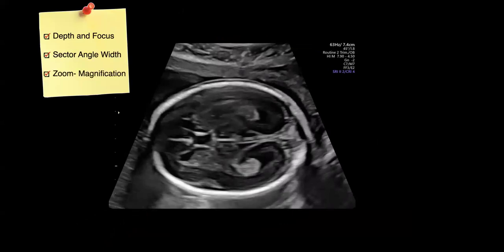So now we've applied our steps such as depth and focus, your sector angle width, and zoom magnification. Notice that your frame rate is at the best as it could be, which is 63 Hertz. You can appreciate the cavum septi pellucidi. You could also appreciate the frontal horns, the third ventricle, and all these structures which we could not see previously, or probably did, but not as well as we did with this image optimization.